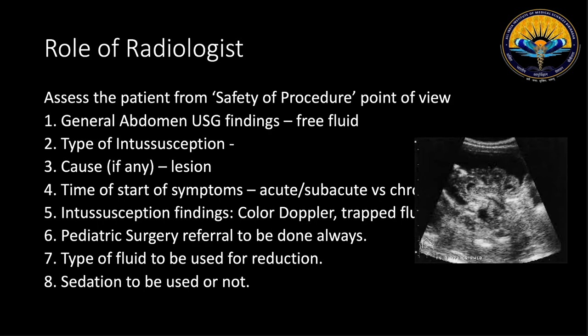Now, the type of the fluid that should be used, and there are multiple fluids that can be used, like normal saline, Ringer lactate, Hartmann solution. However, in our institute, we used normal saline. There are case studies that suggest that Ringer lactate, being very much equivalent to the physiological aspect, is more useful for reduction. Sedation to be used or not.